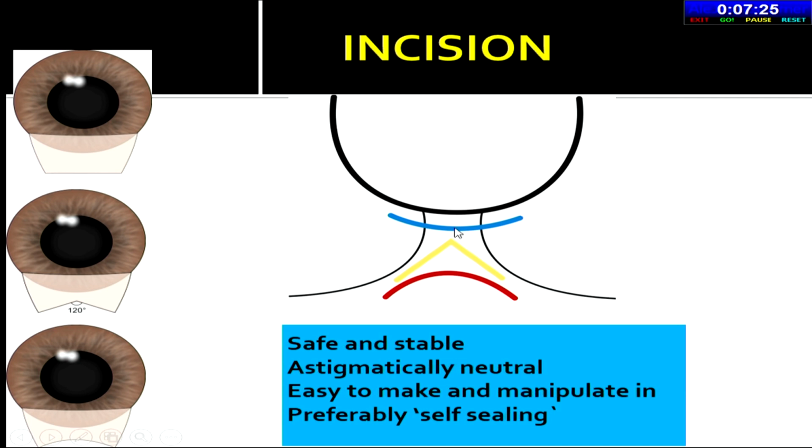The second is that if you want to enlarge this tunnel, how do you enlarge it? The only option is that you move backwards. So that is how the frown incision came into existence. And to further add, now we have started doing 2 straight backward cuts on the same frown incision.